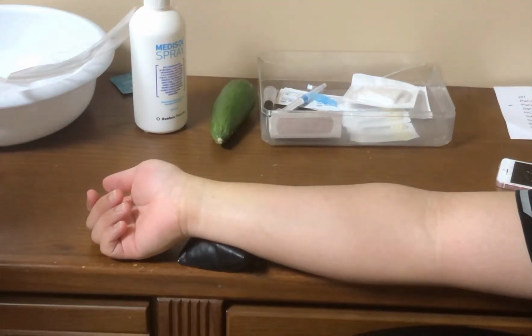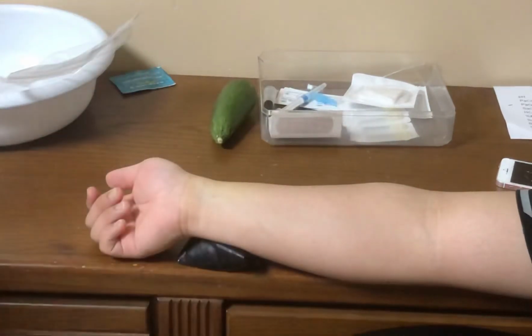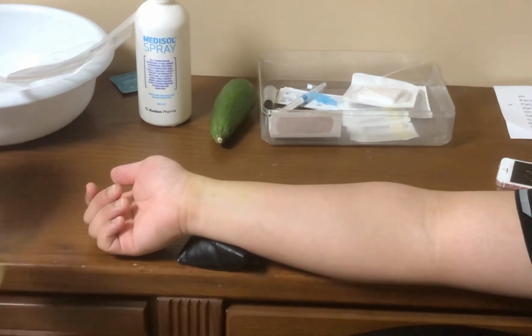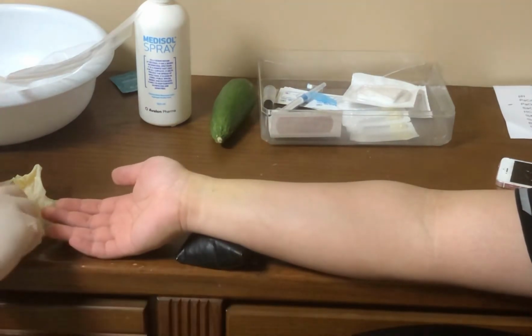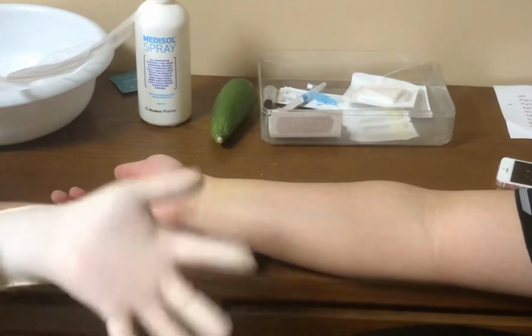So after this, we're finally going to be performing the percutaneous puncture of the selected artery. But before that, make sure to perform hand washing again, and put on your gloves in order to take more measures to avoid any spread of microorganisms or contamination.